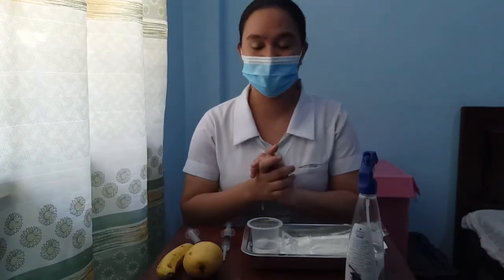So next is select a site. The rationale for this is the site should be free from lesions, rashes, and moles. Selecting the correct site allows for accurate reading of the test site at the appropriate time.